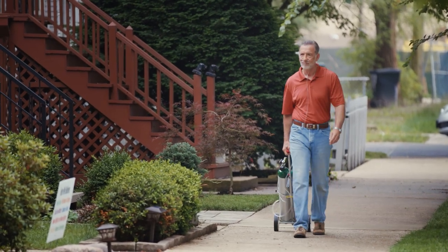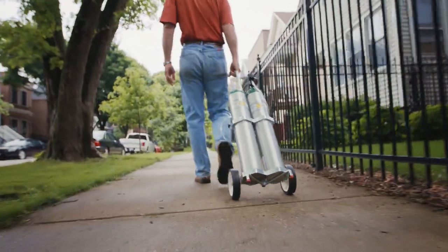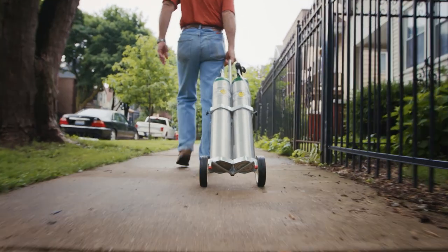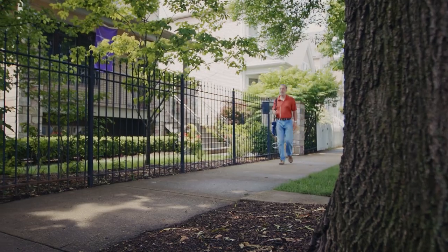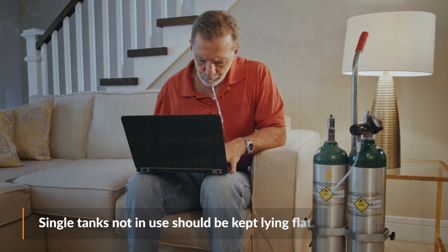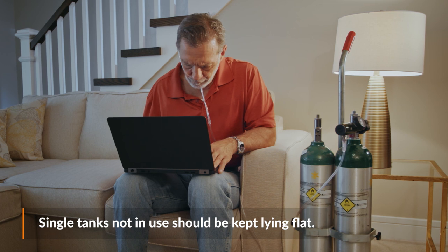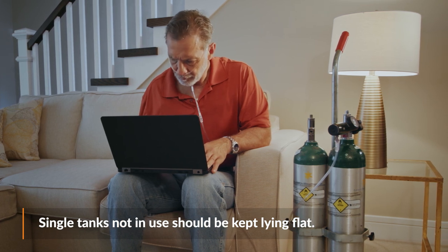You can be mobile while using your metal oxygen tanks. Tanks can be wheeled around in tank carriers for patients that need high flow rates. And smaller tanks can be carried in bags with over-the-shoulder straps. Single tanks, not in carriers or in use, should be kept lying flat so they do not fall over.